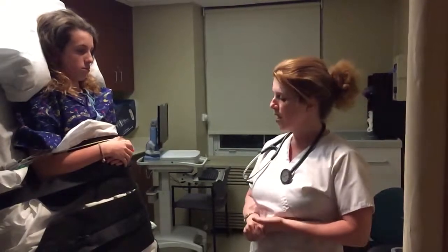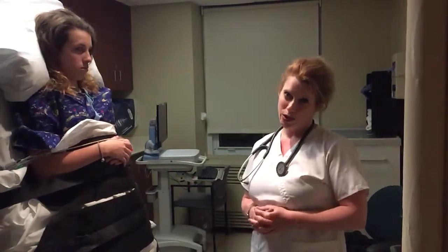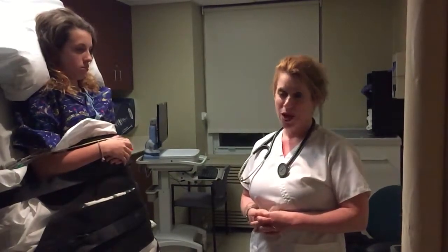The patient is then kept and monitored until they're stable to go home, usually anywhere from a half hour to an hour, and we make sure that they go home with a designated driver. Treatment is depending on the findings of the procedure.